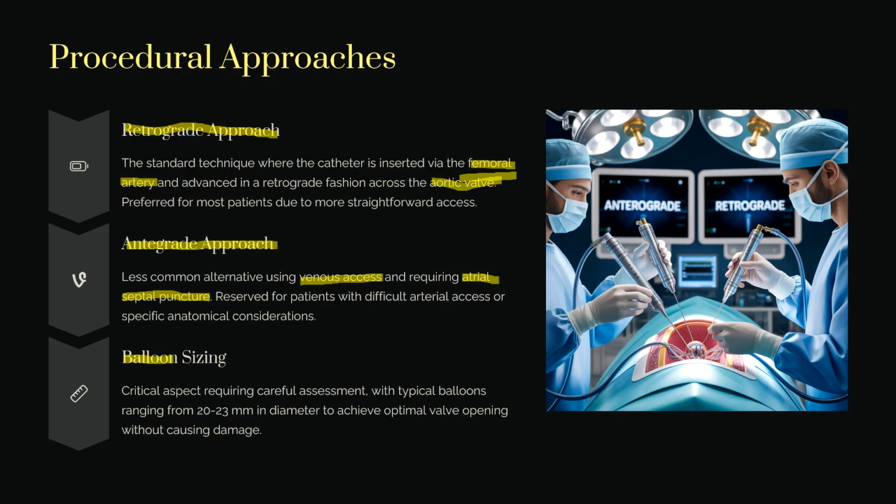Now balloon sizing is also very important. Critical aspect requiring careful assessment with typical balloons ranging from 20 to 23 millimeter in diameter to achieve optimal valve opening without causing damage.